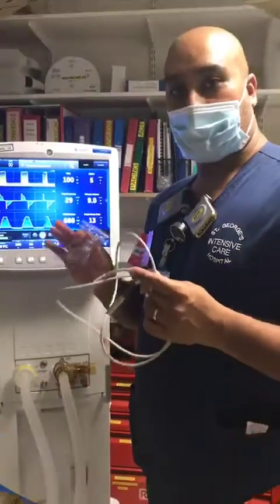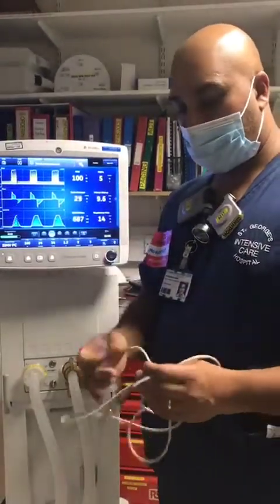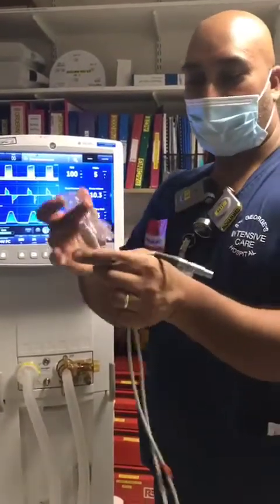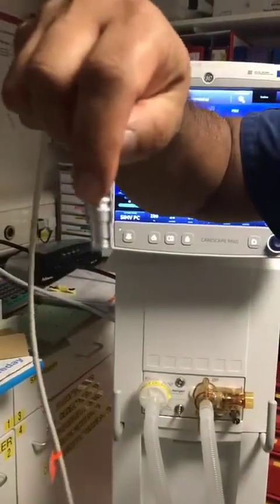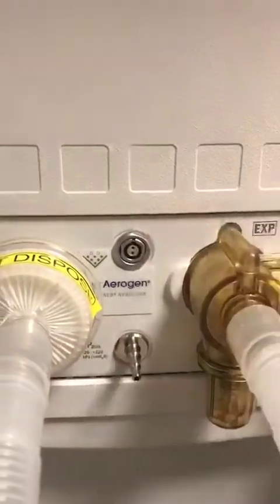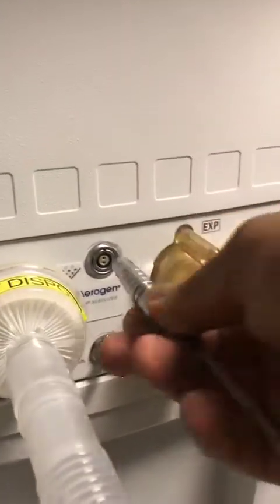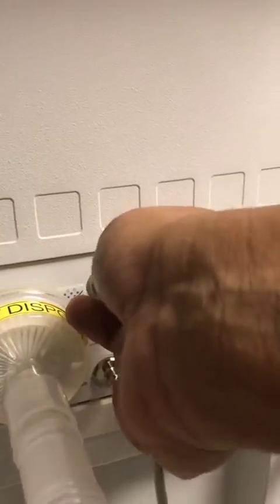We're going to connect a nebulizer to the circuit. We're using an Aerogen nebulizer. You've got a wire like so. You've got the skinny greyish bit that goes in here into the nebulizer. Then you've got the other end of the cable, which has got a red dot over here. On the actual ventilator it says Aerogen. You've got the red dot at the top. You just match it on a 12 o'clock position. It's got 2 pins over here. So just make sure that it's straight and red to red. You push it in like so.